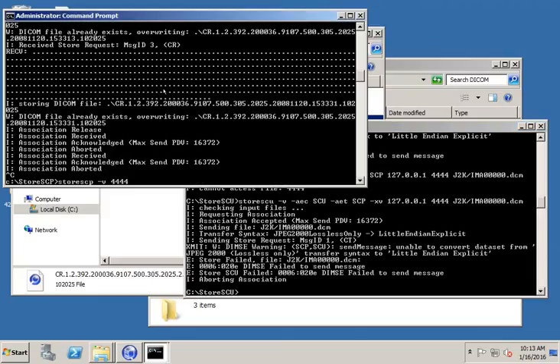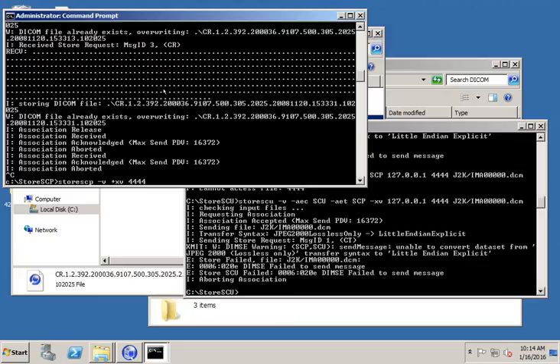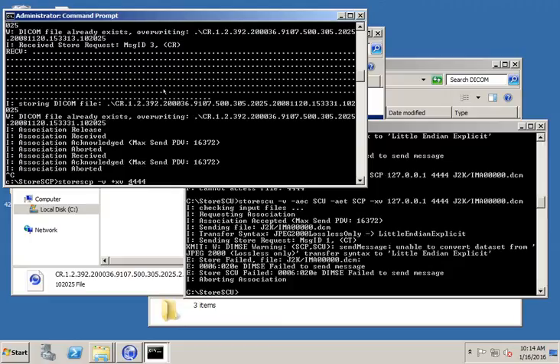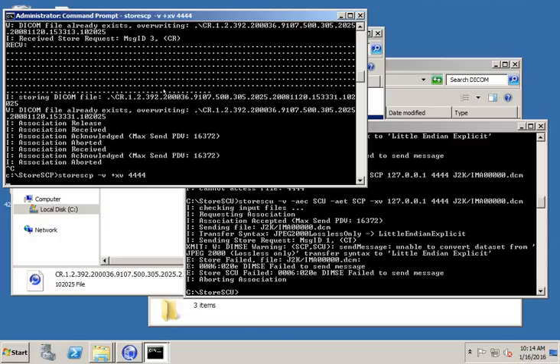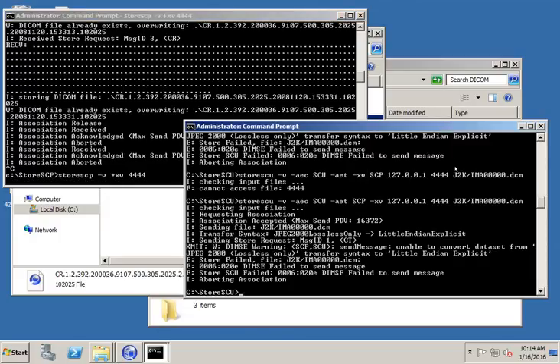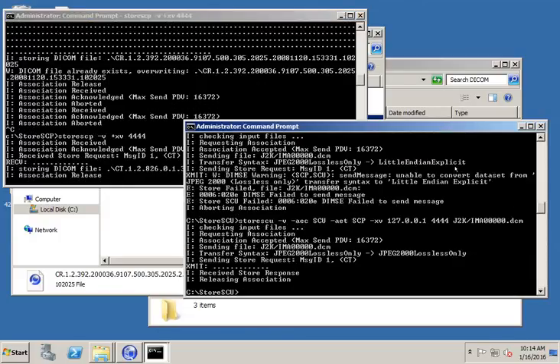On the storeSCP side, I'm going to go ahead and kill that again. There is a similar option on storeSCP. I can put plus xv, which will tell storeSCP to accept JPEG 2000. So right now, when storeSCU is trying to send JPEG 2000, storeSCP is rejecting it because it's not set up to allow that. So one of the options that you'll find in the help is plus xv, which will allow it to accept JPEG 2000. So let's go ahead and run that. So now this should accept J2K. We'll come back over here and try this again. And we can see that it sent the file. It's very small.